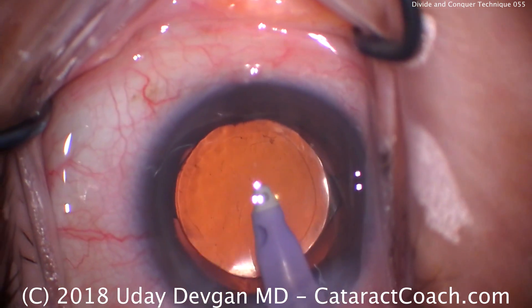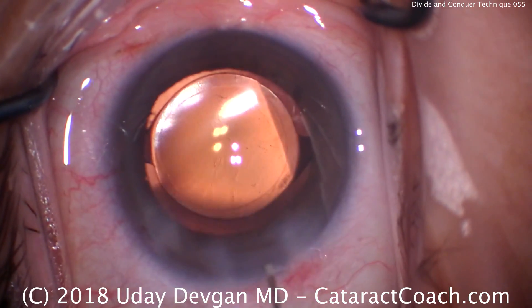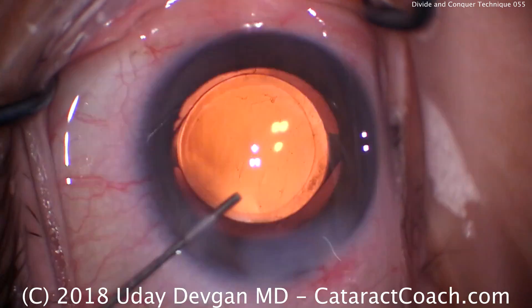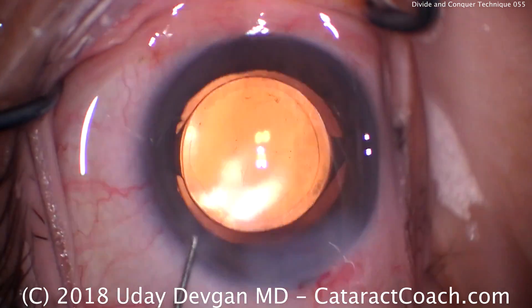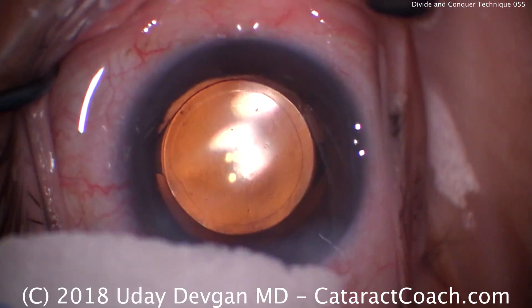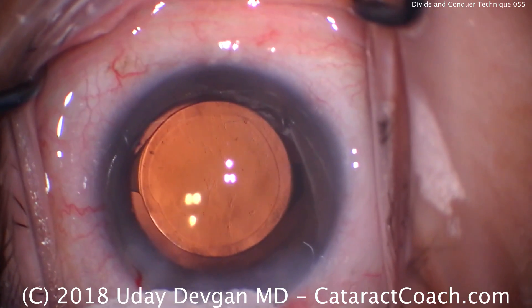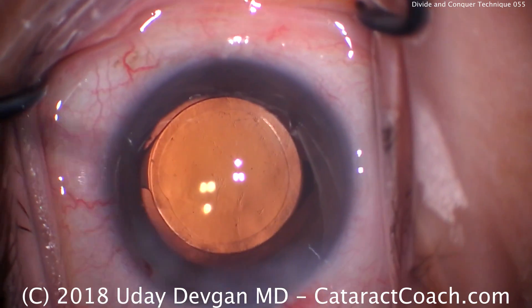All that remains now is to seal up the incisions and call this a day. There you go — a nice divide and conquer technique. Certainly an appropriate technique for many surgeons and a good way to start learning phaco. Just be careful in the way that you do the grooves, understand the depths of the eye, and understand how big the cataract is — where it's denser and deeper centrally and shallower at the periphery. Thanks so much for watching, and be sure to review the video as many times as you need.